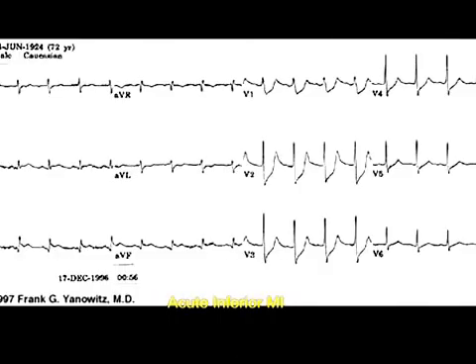Here you can see ST segment elevation in leads 2, 3, and aVF. This is characteristic of inferior myocardial infarction. Leads 2, 3, and aVF will have ST segment elevation and depression in V2, V3, V4 — those are reciprocal changes.